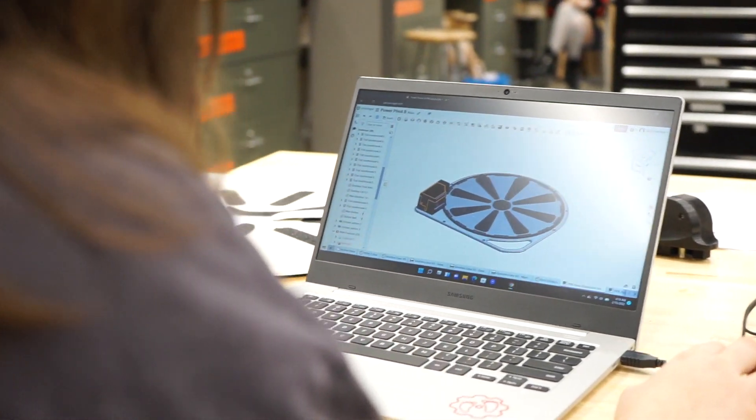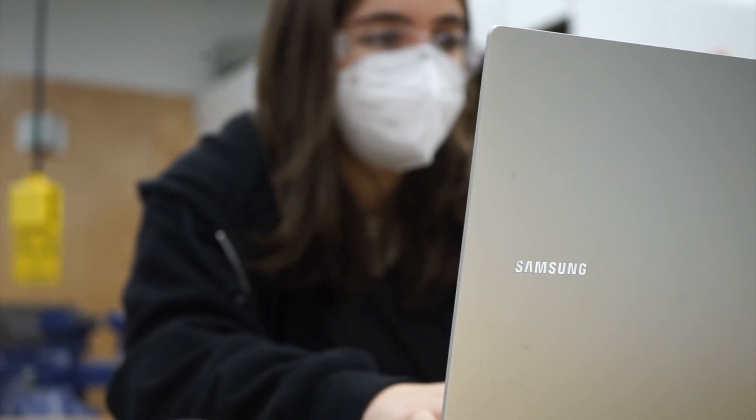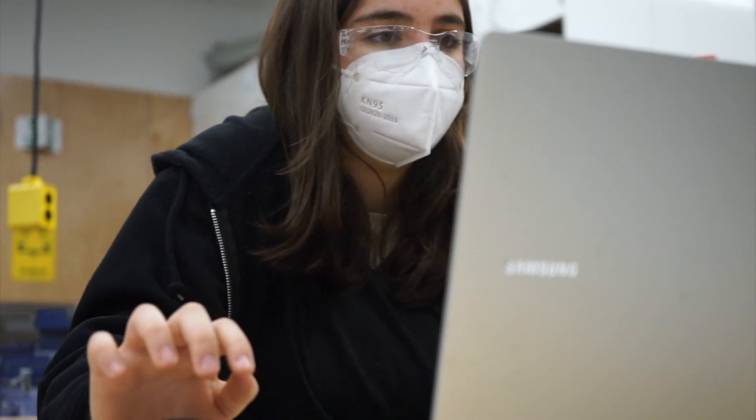Our goal was to create a small powered pivot device that was affordable to the main population. We started this by making a gearbox with a motor, bevel gears, and electronics inside of it.